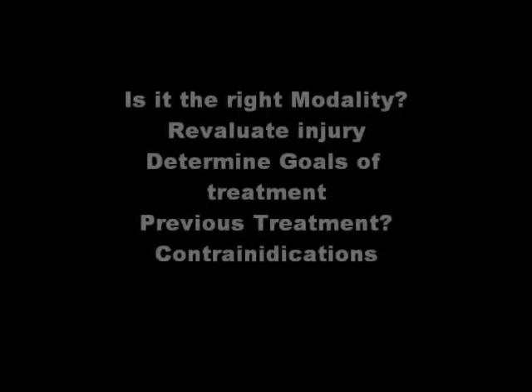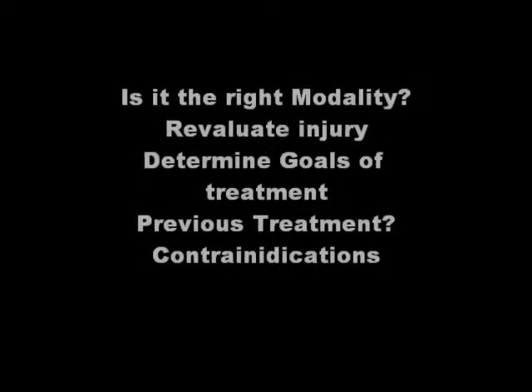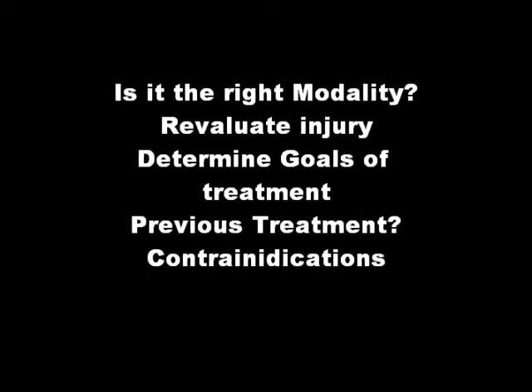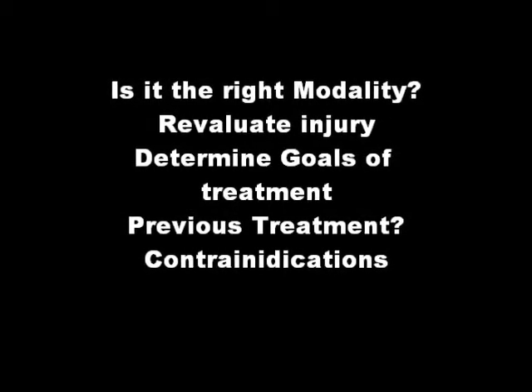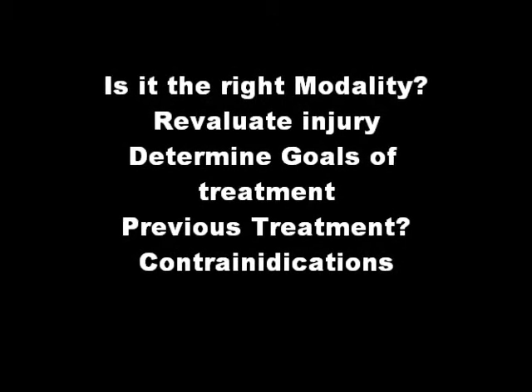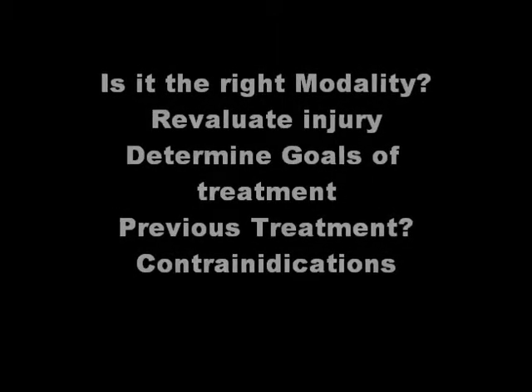Make sure the cryocompression GameReady unit is the proper modality for the situation. This can be completed by re-evaluating the injury and determining the goals of treatment. If a cryocompression treatment was previously applied, the clinician should review how the patient responded. Lastly, make sure a cryocompression treatment is not contraindicated for the patient in this situation.